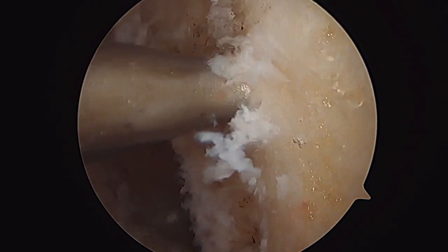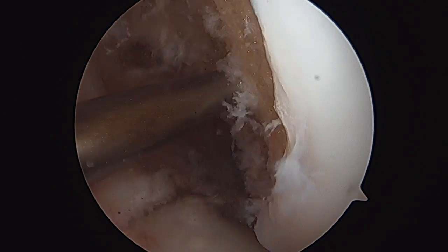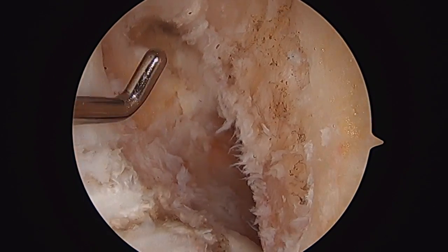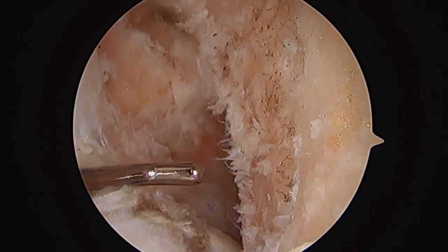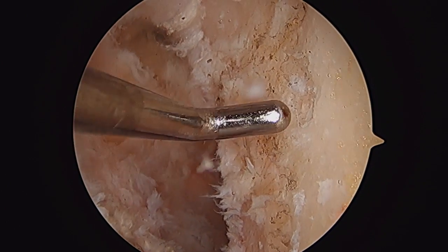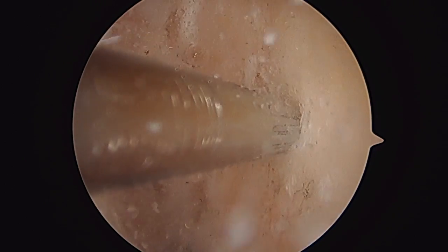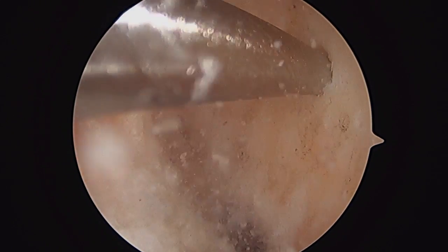So I'm going to select a point in the anterior part of that ACL footprint. If one wants to go in the true center of that ACL footprint, the guide pin very well can go into the back of the knee or out the side of the knee in a non-ideal place. But I can put this tunnel anteriorly where there's a lot of advantages which are delineated in my paper that supports this video. But we can start in the anterior aspect and create a truly anatomic femoral tunnel.